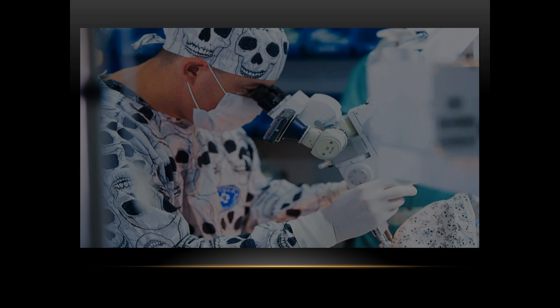Anterior chamber during the surgery is maintained with, in this case, I didn't worry about this. Just put some saline solution and that's it. Sometimes you can use viscoelastic, but you gotta remove the viscoelastic at the end of the surgery. So in this case, considering that we didn't have the collapse of the anterior chamber, we just use a saline solution.